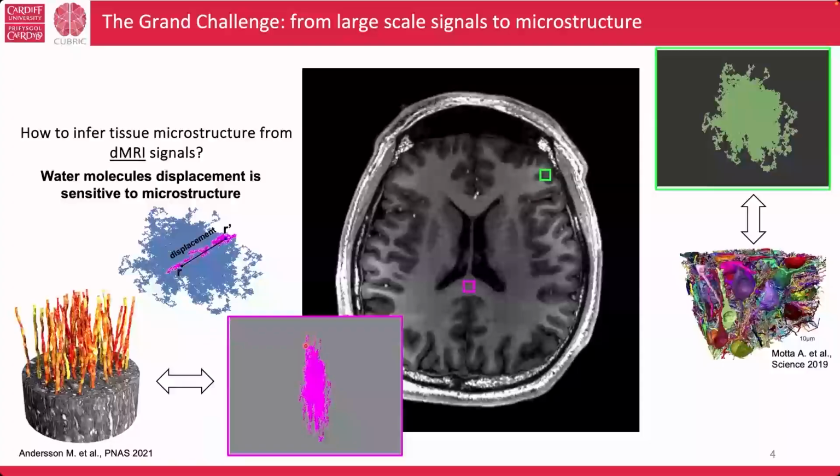If we look at the probability density function of this molecule performing a particular displacement, it has interesting properties. It is anisotropic. And not only can we tell that it is anisotropic, we can also identify the main direction of free diffusion.